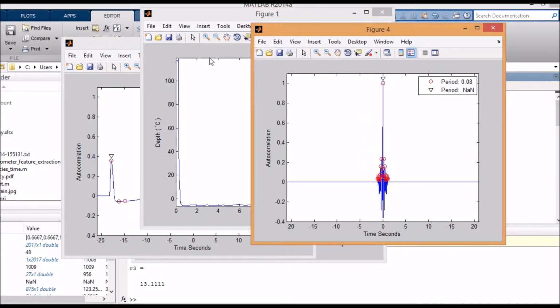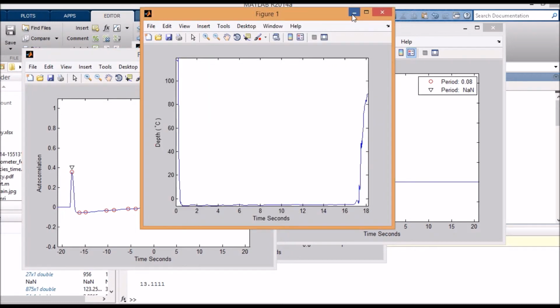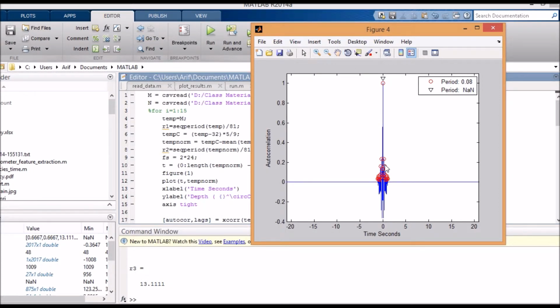Then we found figure 2. Now this is after applying autocorrelation. Now we can see that yes, we can calculate using the depth information. Same thing happens for figure 3. Here we can see that it is difficult to calculate the respiration rate using this acceleration, that means the magnitude of the Microsoft Band. So we use again the autocorrelation and calculated the oscillation, and we found this scenario.